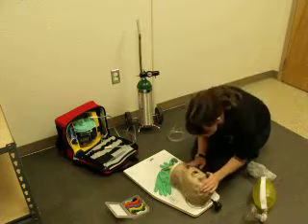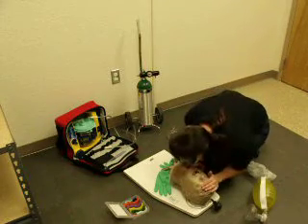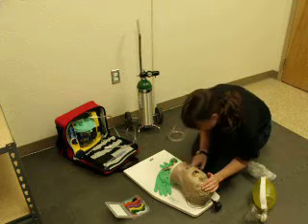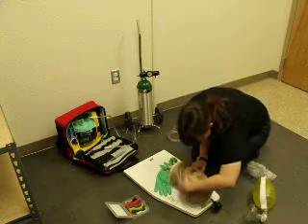BSI. I'm going to check responsiveness and check for respirations. Patient is unresponsive and apneic. I'm going to check for a pulse and open the airway.